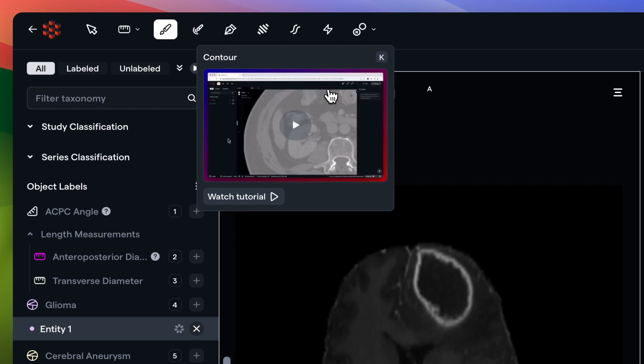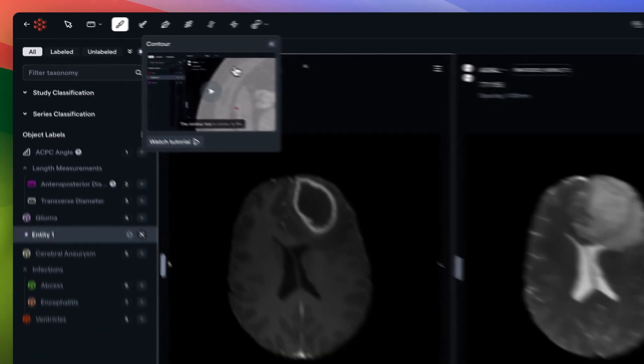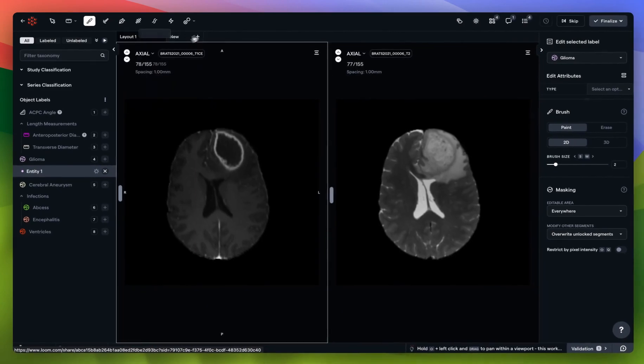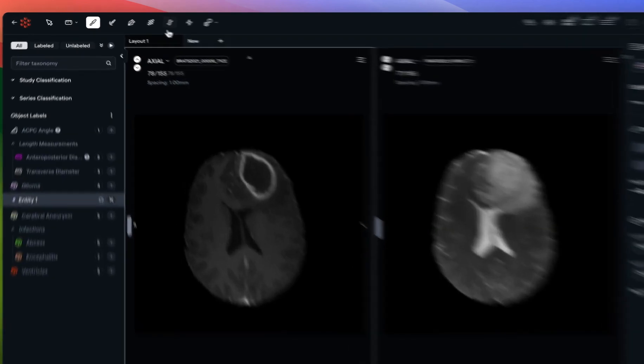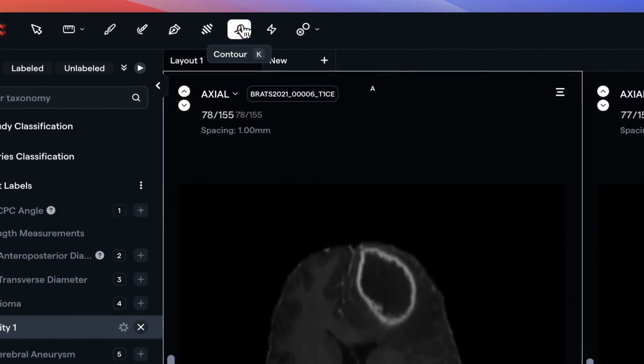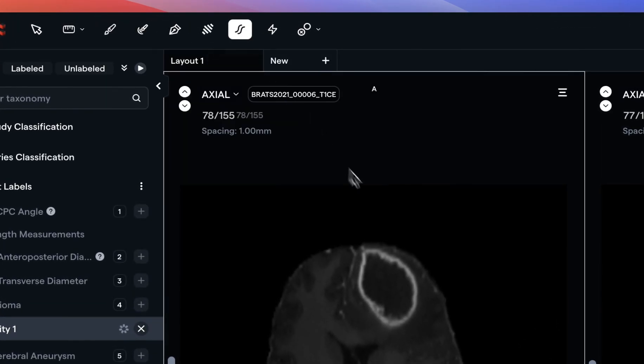The redbrick.ai segmentation toolkit has a wide variety of manual and semi-automated tools. Let's start with a manual contour just to do a comparison here so that we can see what this looks like live.